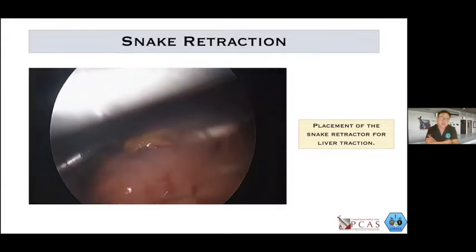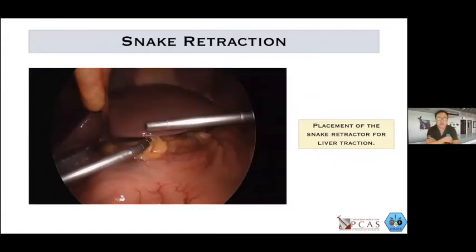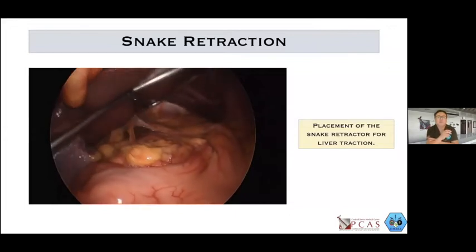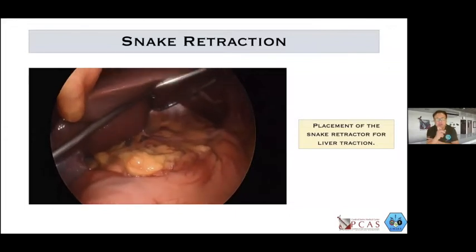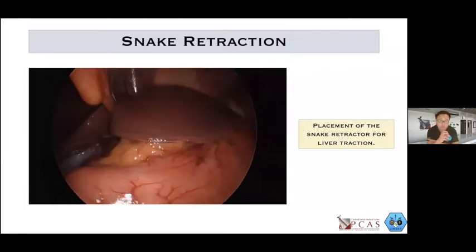It has a malleable end of the instrument, where you can close it up by turning clockwise. Then it becomes a stiff triangular or even octagonal shape retractor, which you can make use of to lift that liver. We would usually make use of this one if you're doing your gastric surgeries, like bariatric surgery or even D2 dissections for gastric cancers.